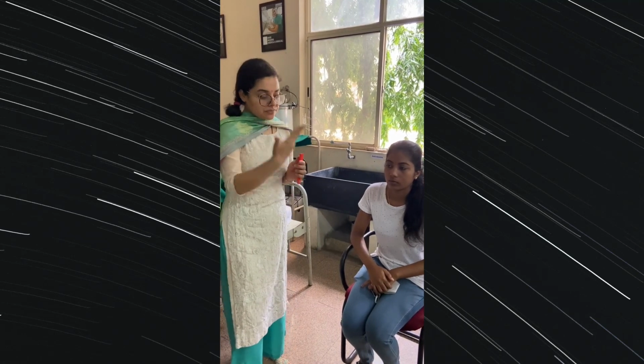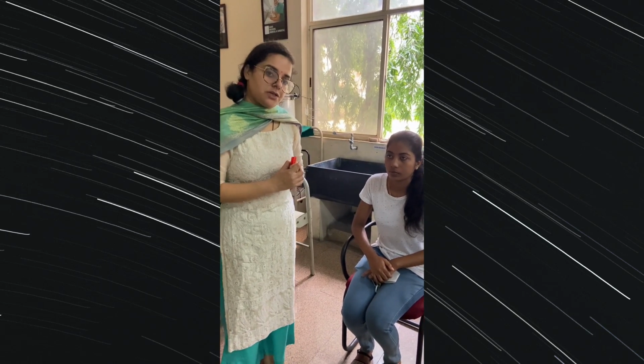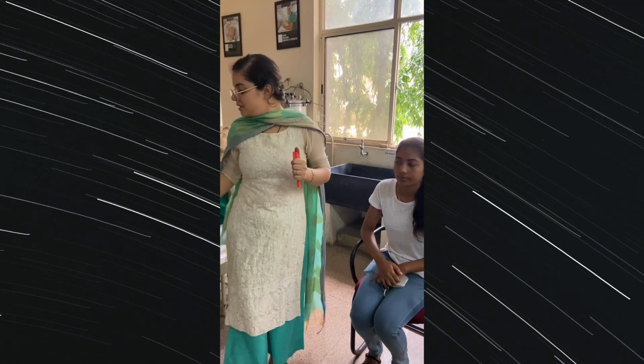And the other side we are going to check is the patient's ability to see with the Snellen's chart. But before the Snellen's chart, we are going to assess the patient's visual power with a magazine.